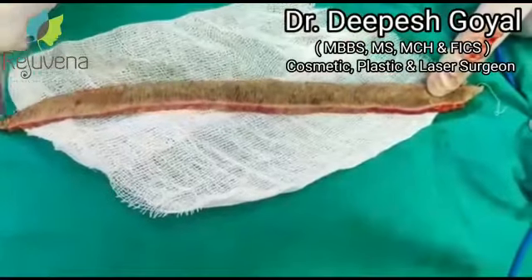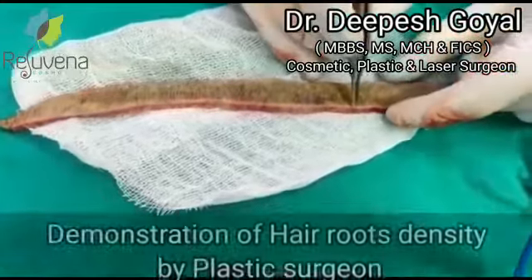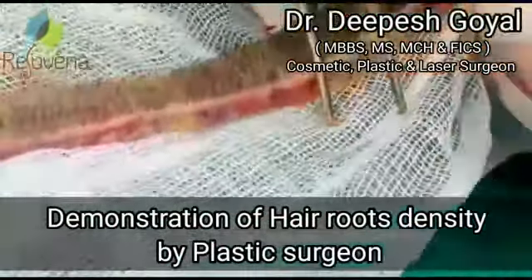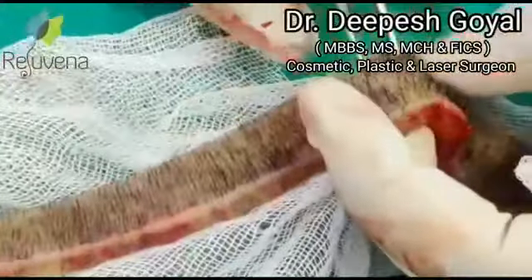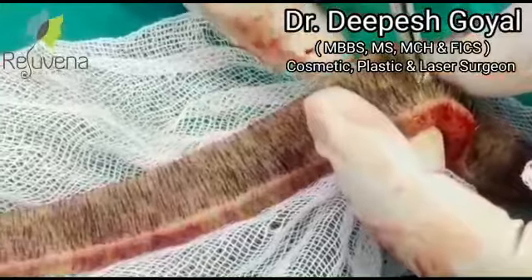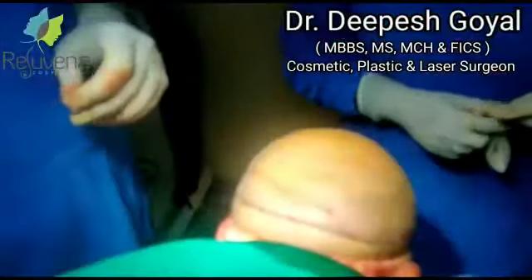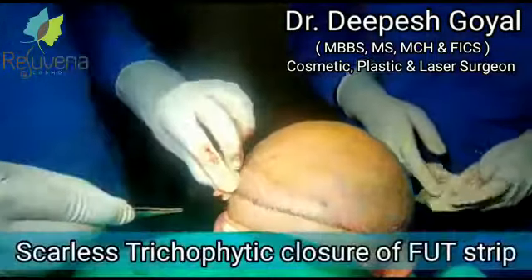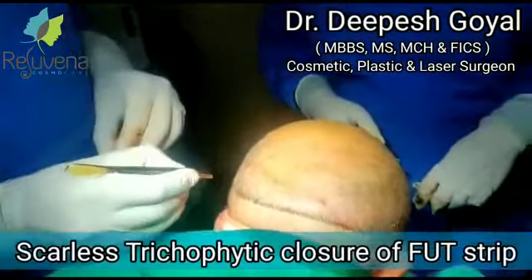As you can see, there are 80 grafts per cm² here. So you can imagine that a 30 by 2 cm strip — that is 60 cm² — at 80 grafts per cm², gives us around 4800 hair grafts we can achieve from this strip.